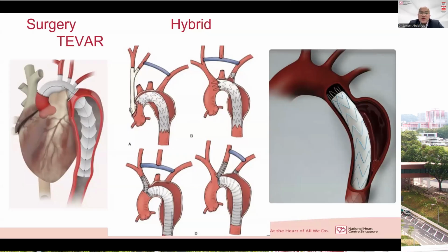And an example on the right is when we are talking about complete endovascular treatment in patients who are suitable. What you see is the aorta. There's an aneurysm in the descending thoracic aorta. And so that's the enlargement over there.